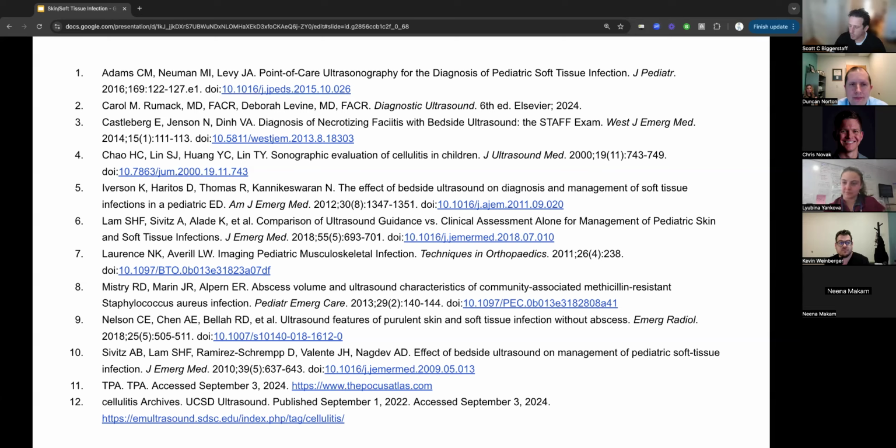And you brought up a good point about that surrounding area. You think about abscesses being sort of the eye of the storm, and then there's still the hurricane around it, right? For an abscess, you're going to have that discrete area in the middle, but you're still going to have evidence of skin and soft tissue infection around it, so that cobblestoning appearance and tissue disarray. Whereas with a cyst or something, typically it's more isolated. You're going to see that anechoic signal, but the surrounding tissue looks relatively normal.